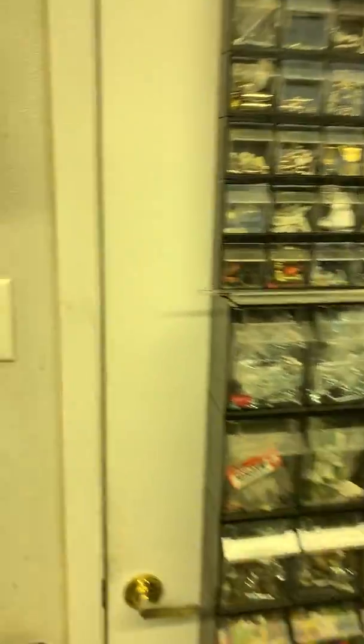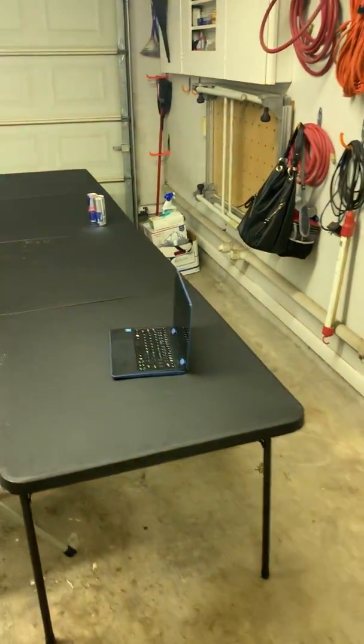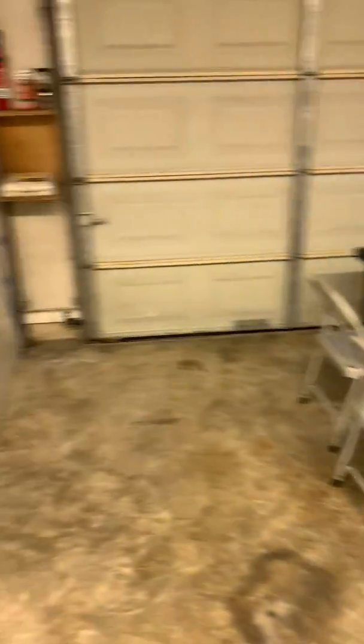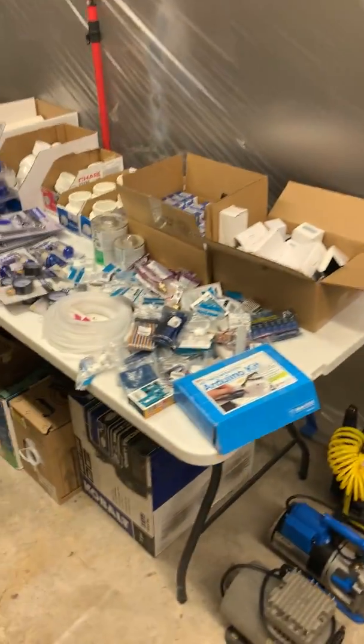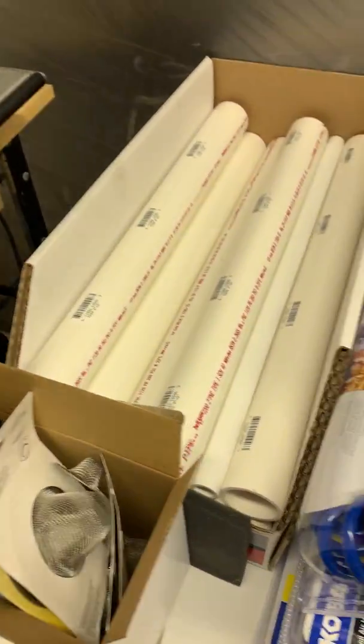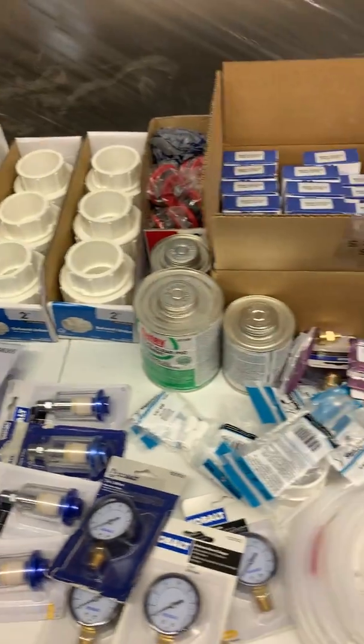I'm gonna give you a quick tour around so you can see what the environment looks like, so come with me. We're gonna start the tour out in the garage. I've set up some assembly tables here. Over here we have the parts we'll need. We're trying to use commonly available parts so these can be assembled all over America.